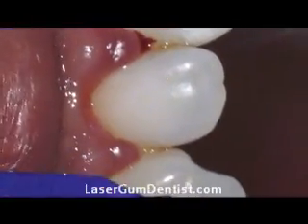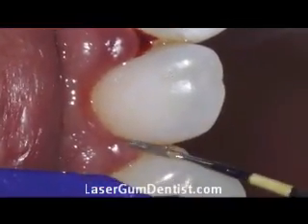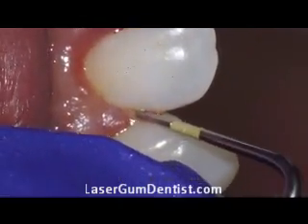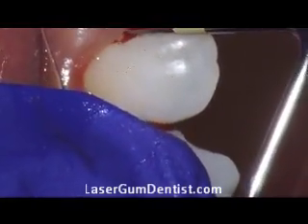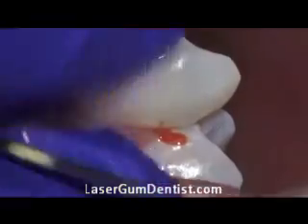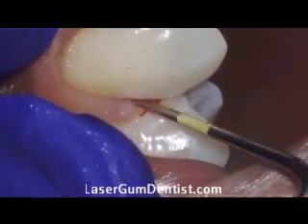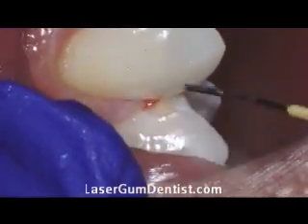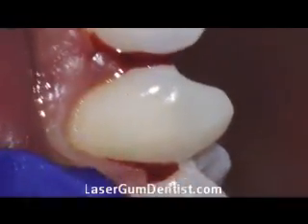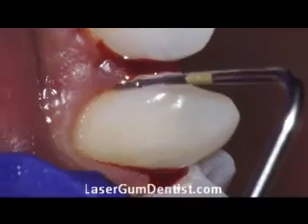You can hear me calling out the numbers of this patient. In the after video I don't call out the numbers. To get a sense of what this patient has, if you look at the amount of bleeding and the depth of these measurements, this patient had advanced periodontal disease.